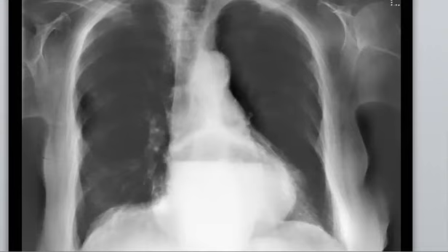So mention the positive, the most important things, and mention, for example, for the ulcerative colitis case we showed you, that this patient should have a mention of whether there is free air in the abdomen or no free air in the abdomen, because this is the most important negative.